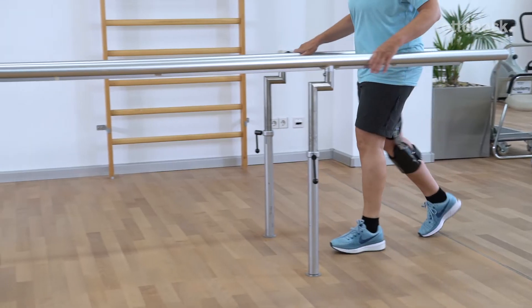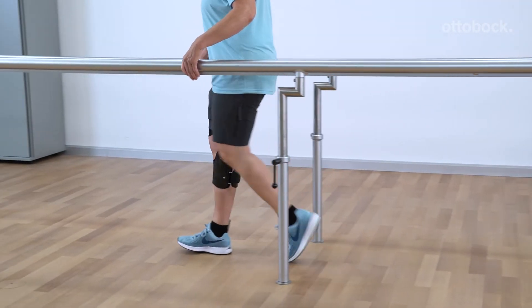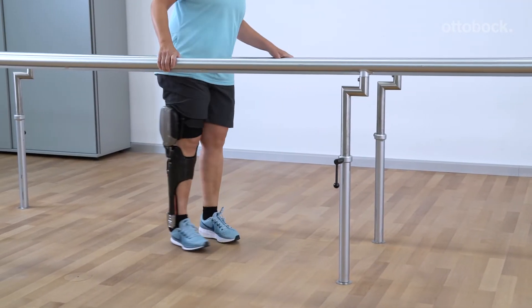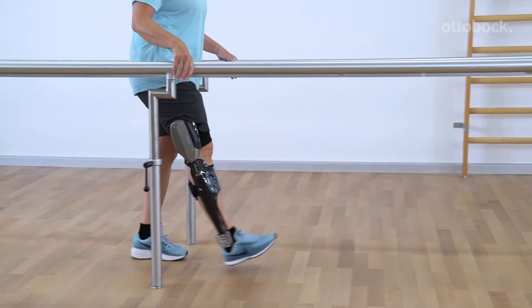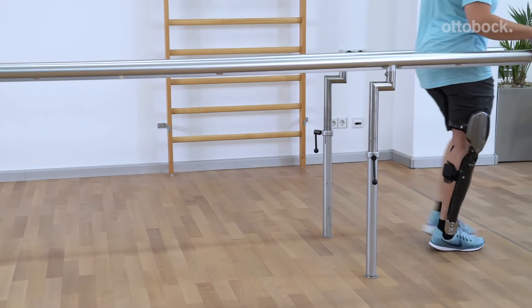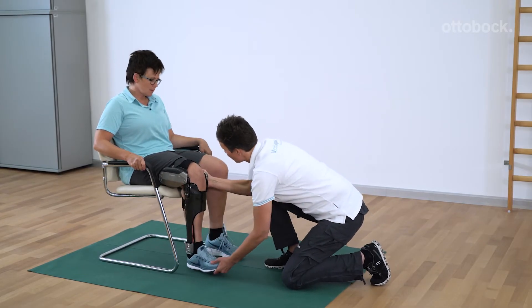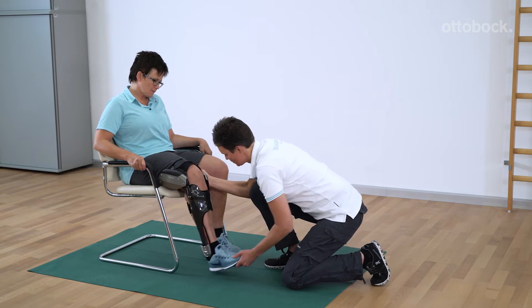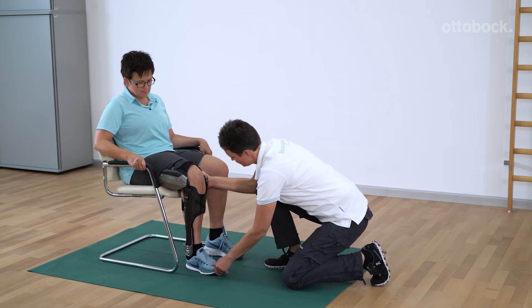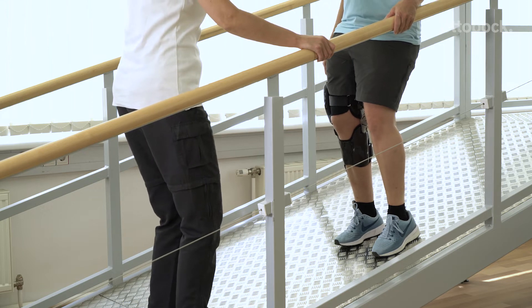The patient mainly uses the C-Brace in Basic mode. This mode enables physiological walking with stance and swing phase control. The sitting function and the stance function are only available in Basic mode.